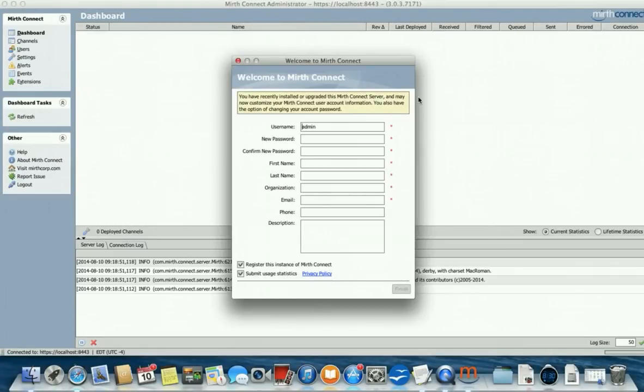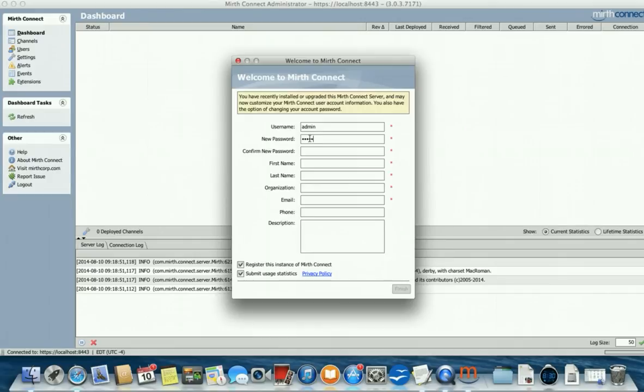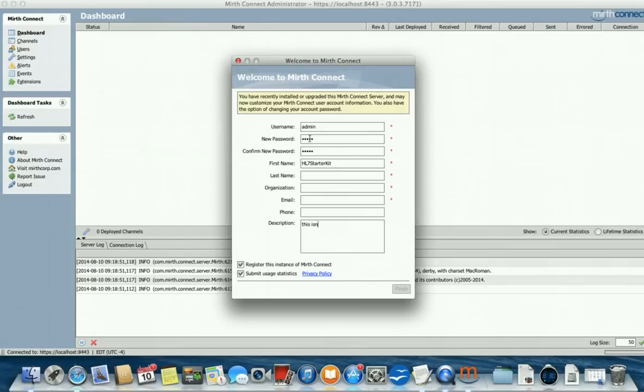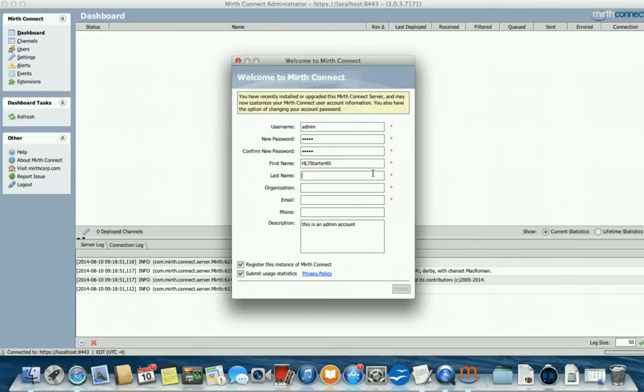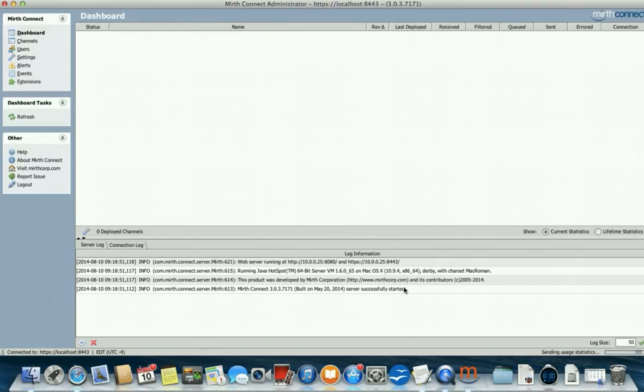I believe the installer should load Java for you, but if it doesn't, let me know and I can help you with that too. Because I didn't install Java on this MacBook and you can see it's running. So yeah, I suggest you leave the admin account. Let's pick a new password, pick the admin first name. This is an admin account. All the same. There we go. Alright. Click finish and you're in. That's it.